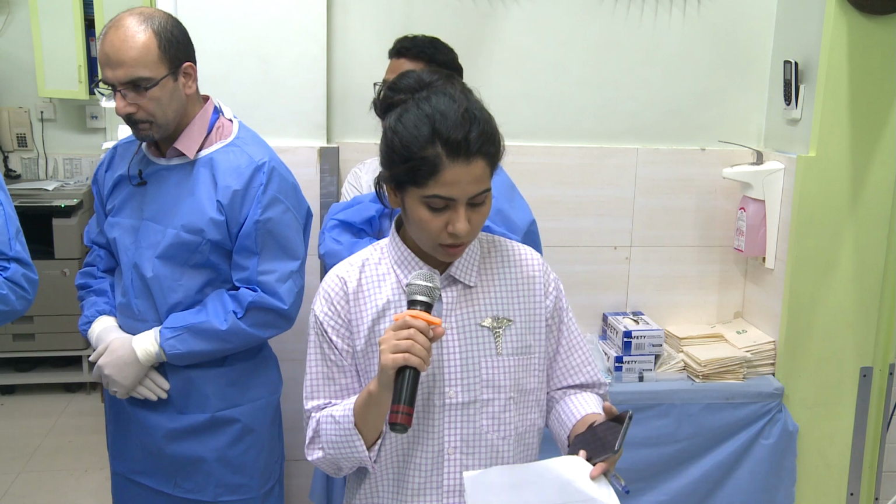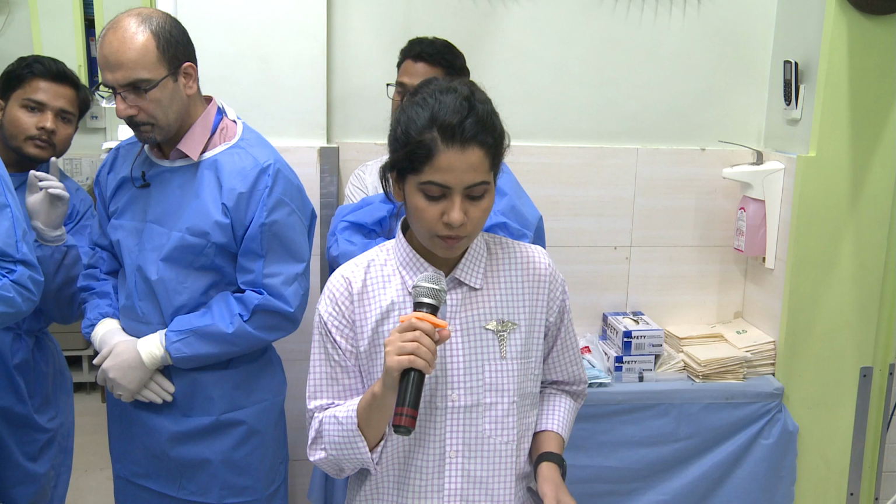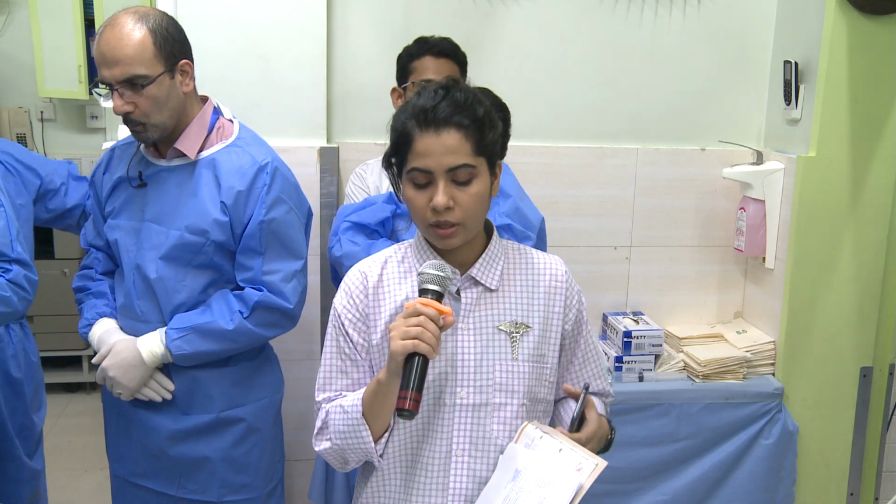The ERCP showed a large growth at the ampullary region, and cannulation was achieved, and a stent was placed in the CBD. So we are now proceeding with the EUS.